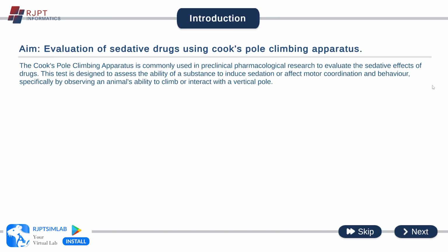In this video, we will study the evaluation of sedative drugs using Cook's pole climbing apparatus. At the end of this video, we will be able to tell about the effect of sedative drugs, which induce sedation in animals, by using the Cook's pole climbing apparatus. Let us start with the video.